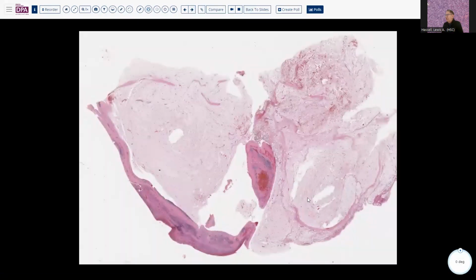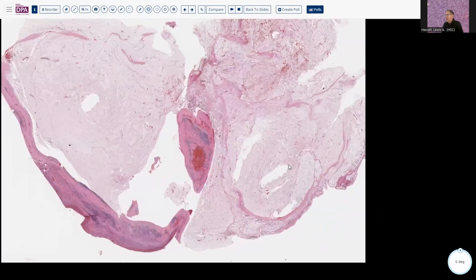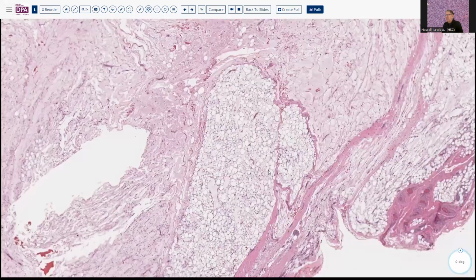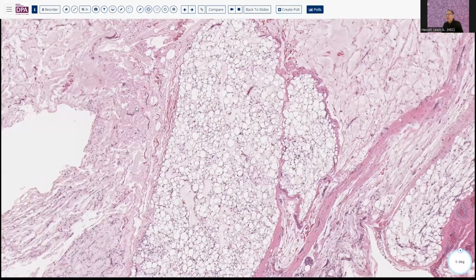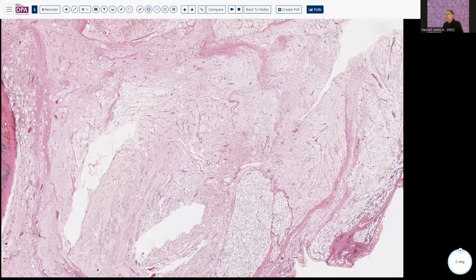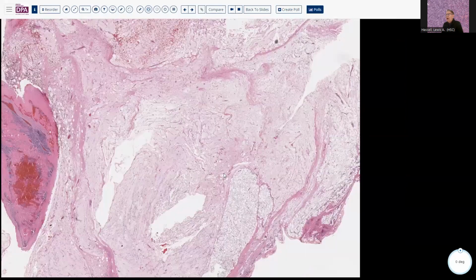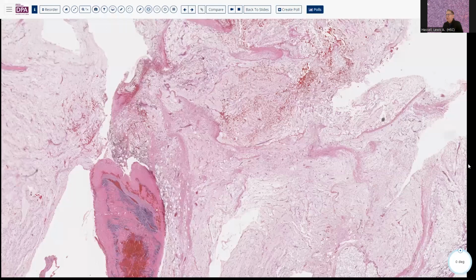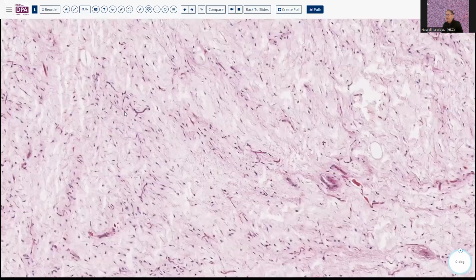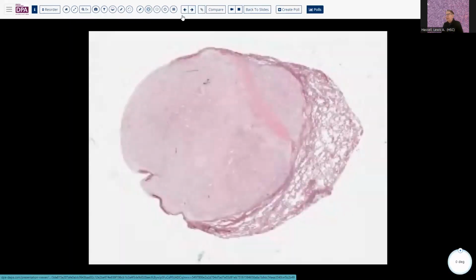And if you want to cement your knowledge a little bit more firmly, here's a fourth example, a little paler, much more myxoid, relatively little fatty differentiation other than perhaps here, but very myxoid, not quite as prominent a vasculature. It would certainly, I think, require the fusion gene demonstration to be totally convincing that this is not something else. There's a little bit of vasculature here, but it's rather scattered and not terribly pleomorphic. So that's the value of having your FISH testing capable to detect this lesion.